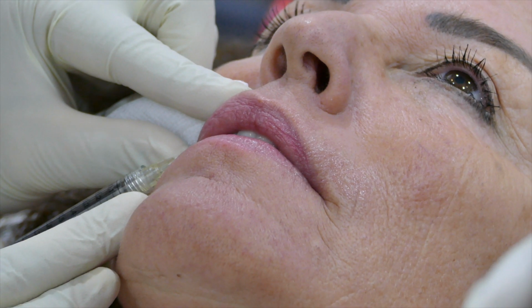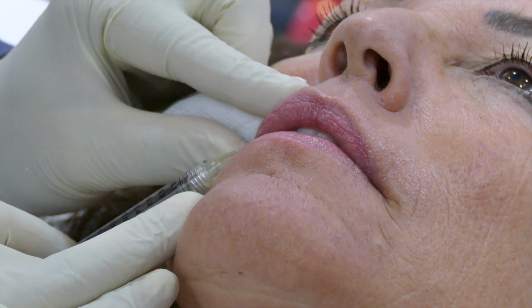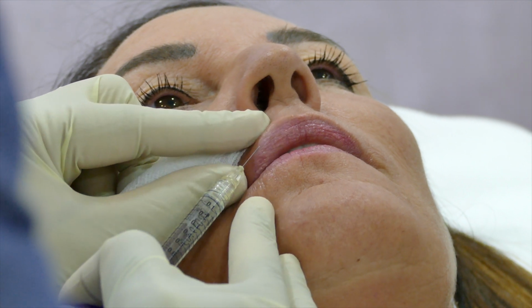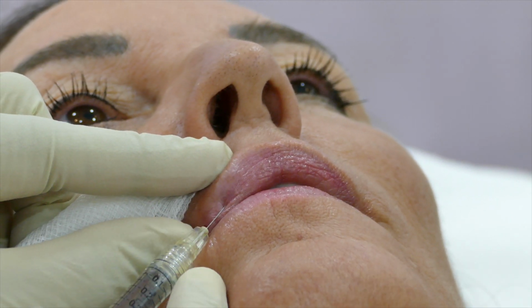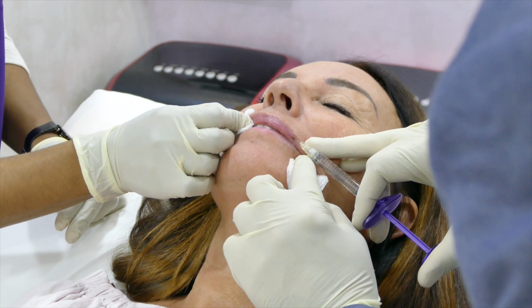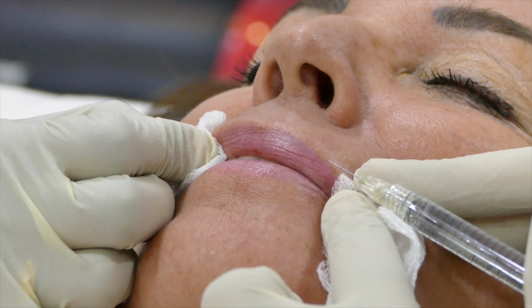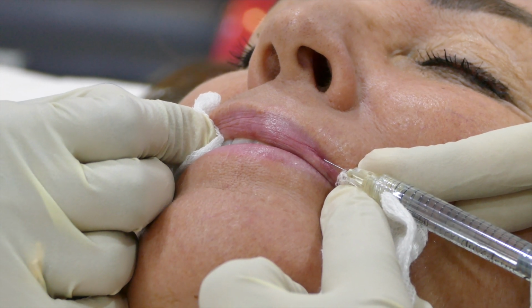This is yet another filler patient where I'm just rejuvenating the lip. As you can see, she has quite wrinkled mucosa and does not want significant volume enlargement. So this is just submucosal injection using very low G prime filler to hydrate the mucosa and to stretch the mucosa to erase the wrinkles.